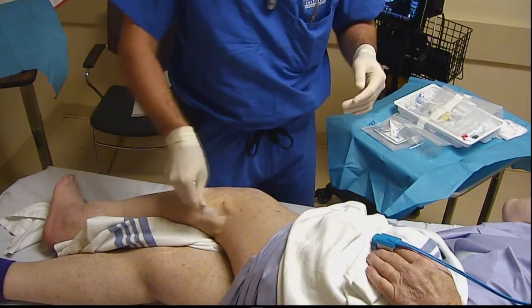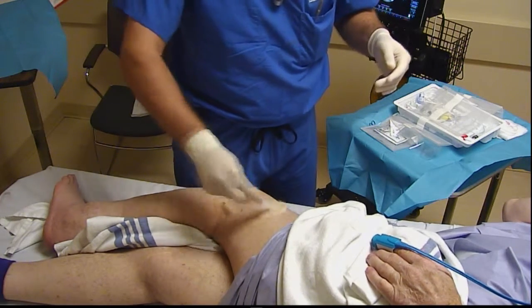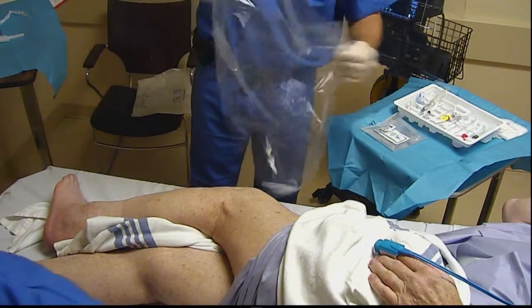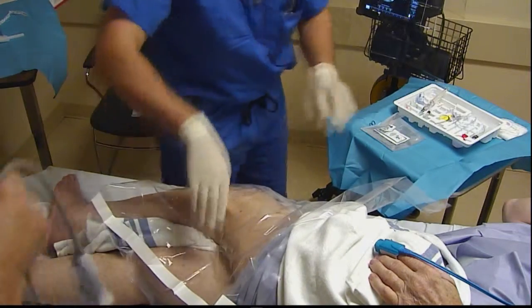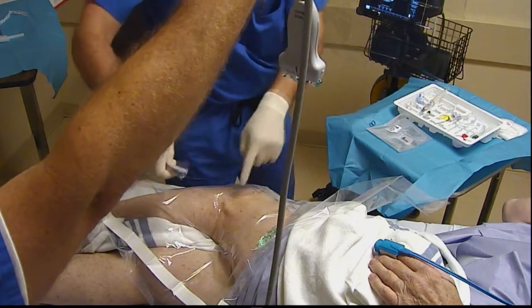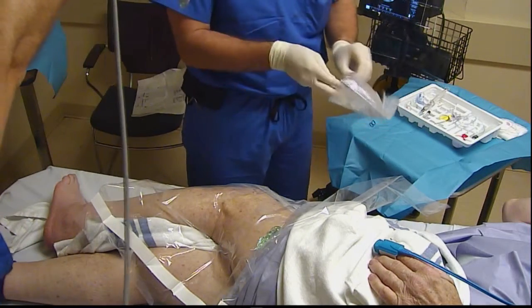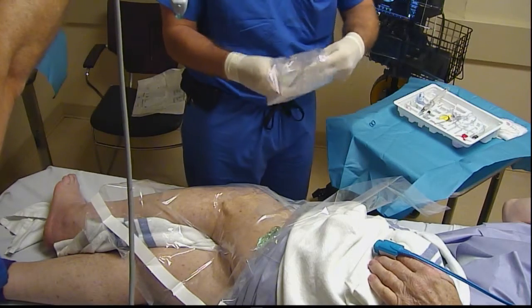I'm going to make a nice wide chlorhexidine prep because we're going to scan from the popliteal crease all the way to about a hand breadth or two above the knee. Notice I don't take any of the sticky stuff off — leaving that on allows you to slide your sterile drape proximal and distal on the leg.